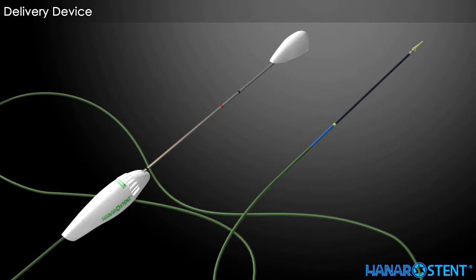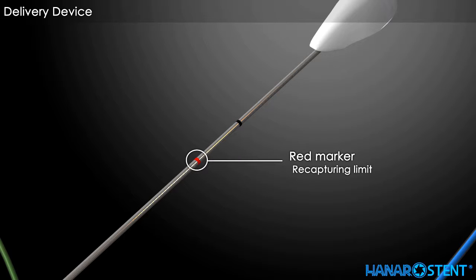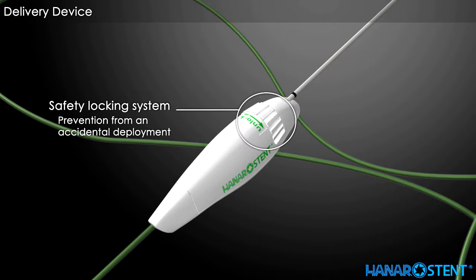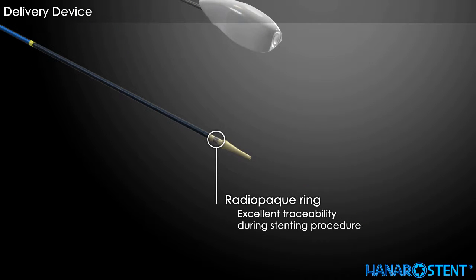This is the delivery device for the Hanaro stent biliary. A black marker on the delivery device indicates the full deployment of the stent. A red marker indicates the recapturing limit, or point of no return. The locking system prevents accidental deployment during placement. A yellow marker indicates the proximal end of the preloaded stent. A radiopaque ring aids excellent awareness of the deployment procedure through the fluoroscope.